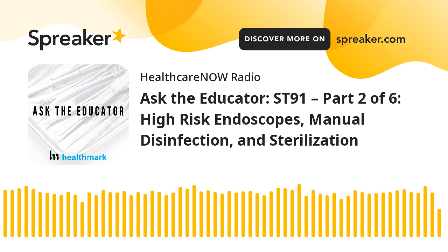Bronchoscopes are considered to be high risk. Your endobronchial ultrasound scopes, also known as EBUS endoscopes, those are high risk. And always your ureteroscopes and cystoscopes. So those are the types of endoscopes that are always considered high risk and should be by all facilities.